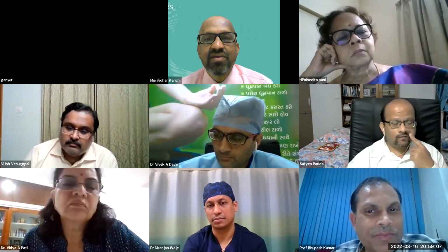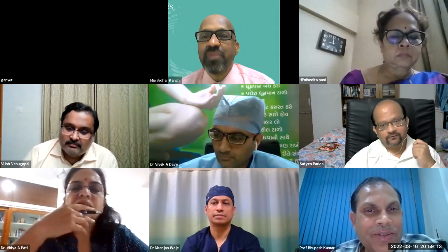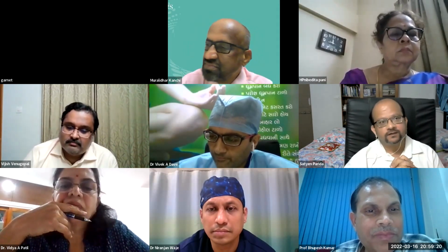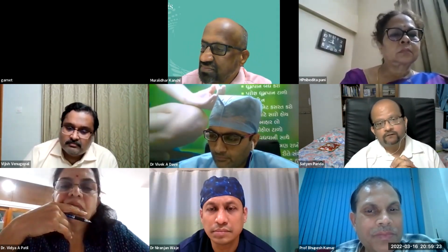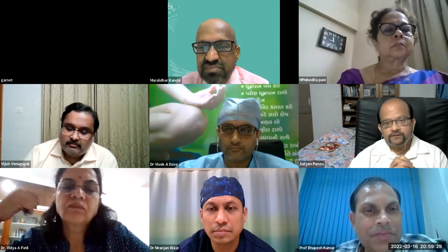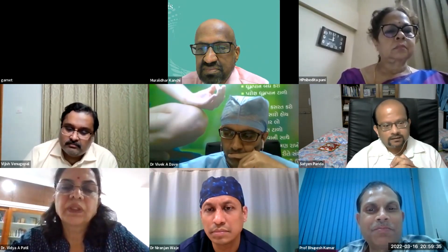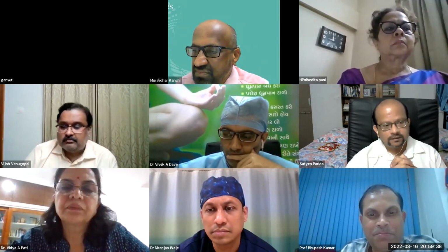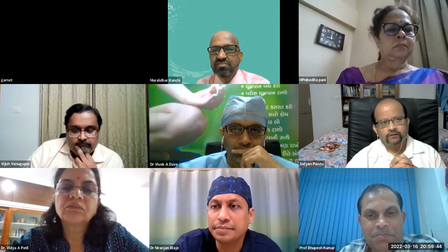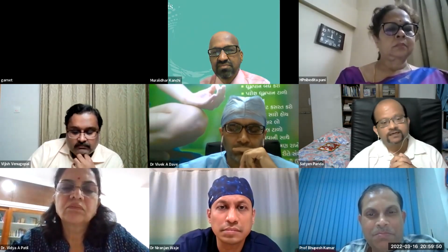company people? Anyone can answer. I have worked with it for some time. They gave me a set of their transducers and everything to work with. They also left the HPI module with us to work with for about a month or two. Like everything else in artificial intelligence, it's promising, but we did not conduct a systematic study of the entire device. It looks promising, but I think there's still a long way to go before we can completely rely on those parameters to predict hypotension.